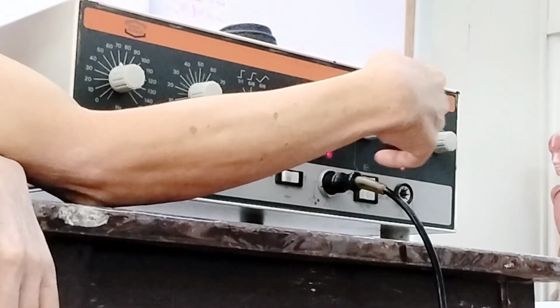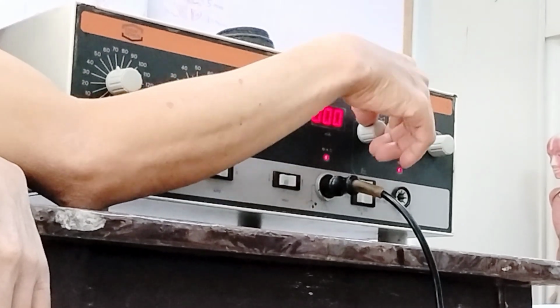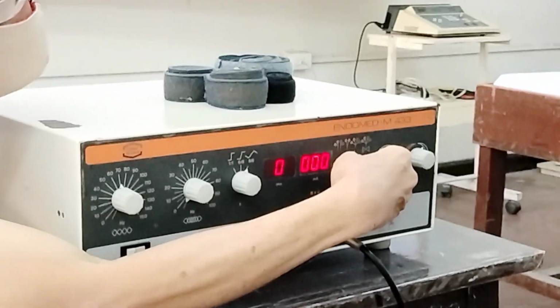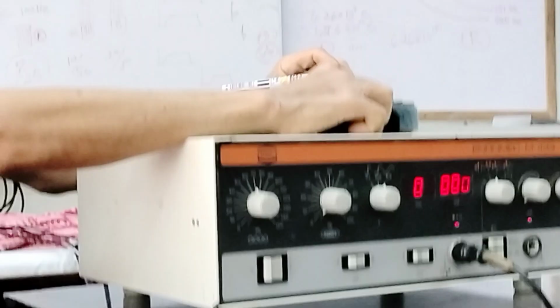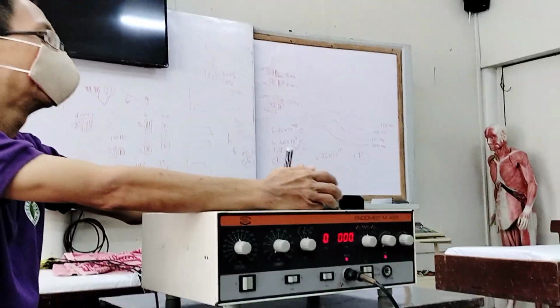Oh, I forgot about muscle stimulation. Let's go back. There are times, for example, when you are using quadrupolar without vector scan. Let's say you place the four electrodes, the fourth electrode on the back.